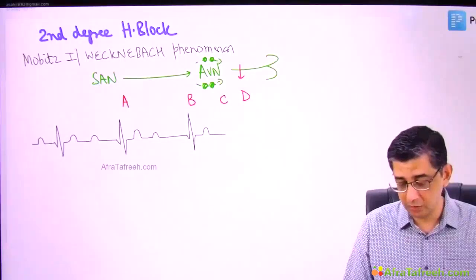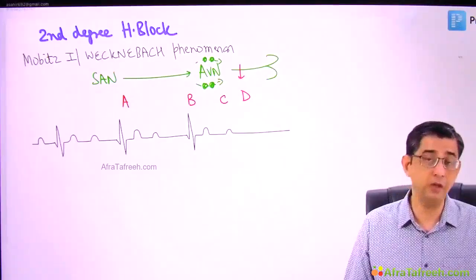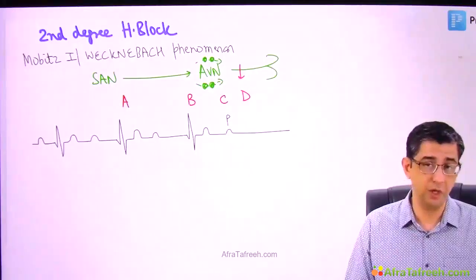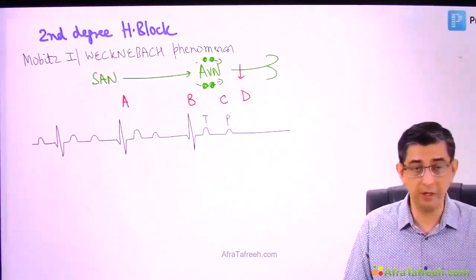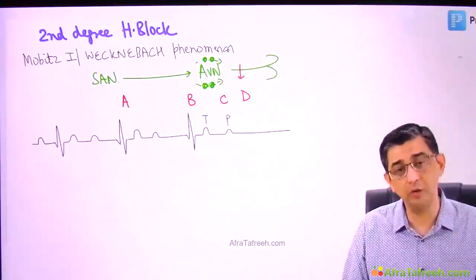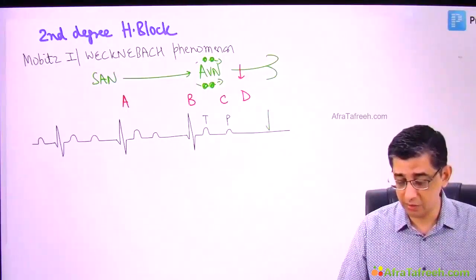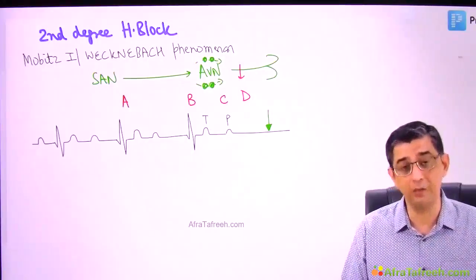Whenever you see the ECG of this person, you will always see an area where after the P wave, you will notice there is no QRS complex. You definitely can differentiate between the T wave and the P wave based on the height criteria. I've explained to you that the height of the T wave in the limb leads is 5 mm, in the P wave it is 2.5 mm, so by the height you can differentiate. But now I'm putting a vertical arrow here to say that this is the site where I expected the QRS complex to be present, but it is sadly not present.